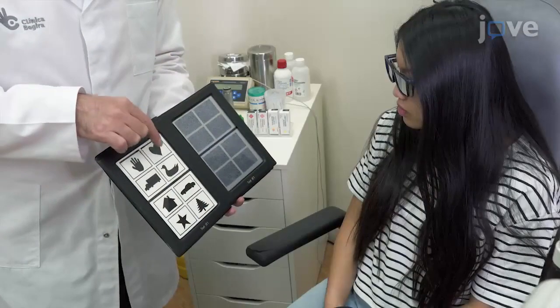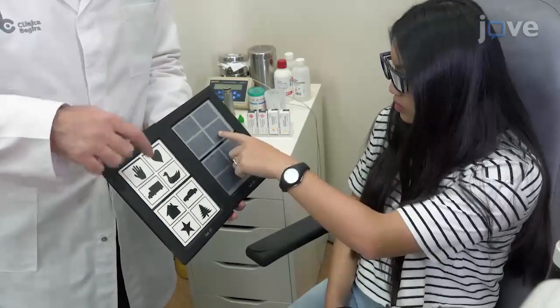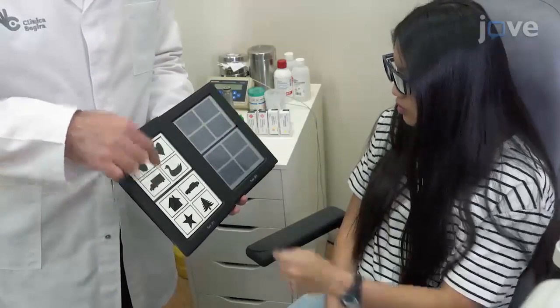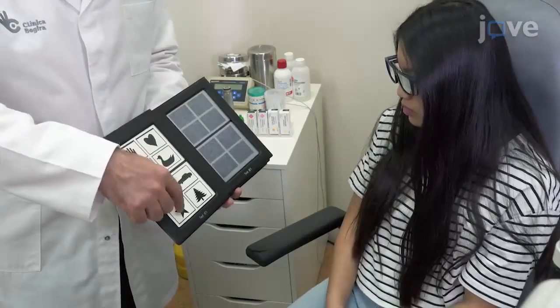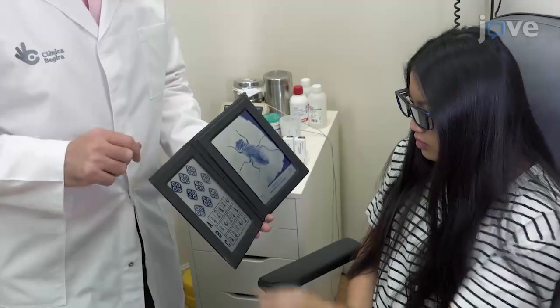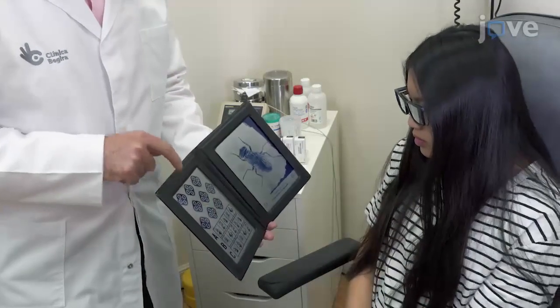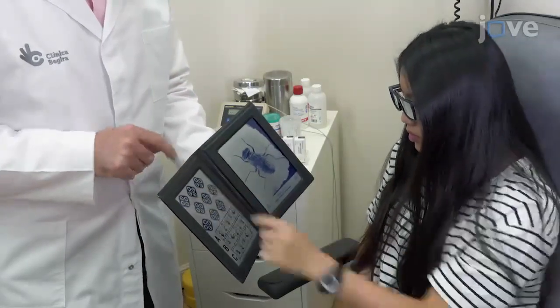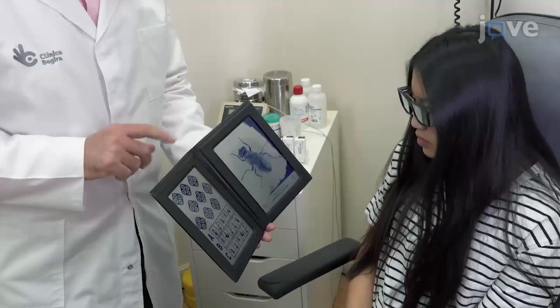Measure the global stereo acuity with a random dot stereogram conducted according to the manufacturer's instructions. Measure the local stereo acuity using a contour test with a Wirt circles test, conducted according to the manufacturer's instructions.